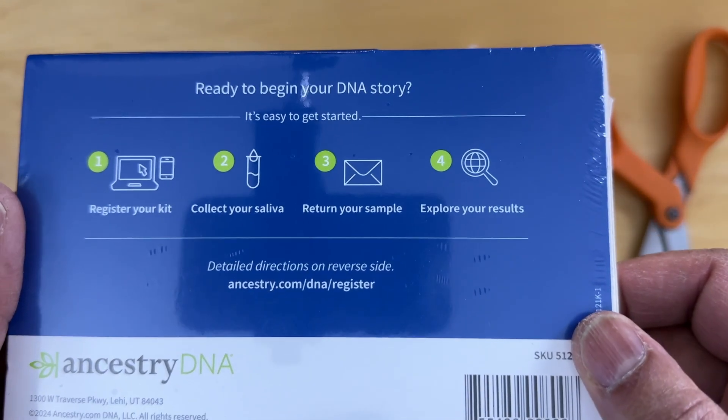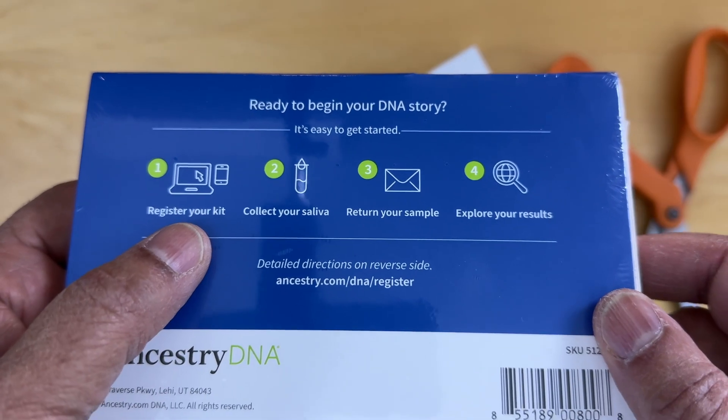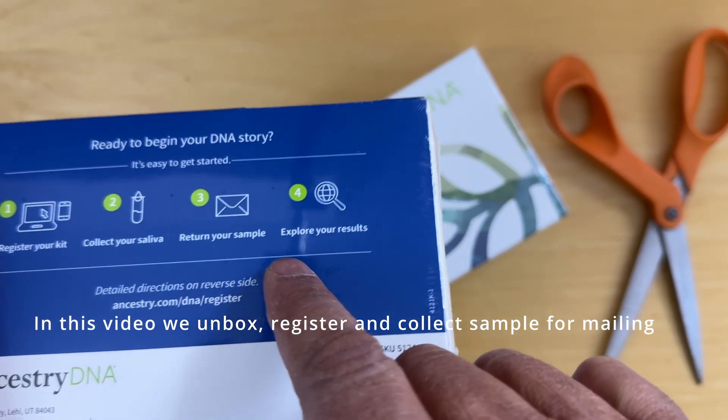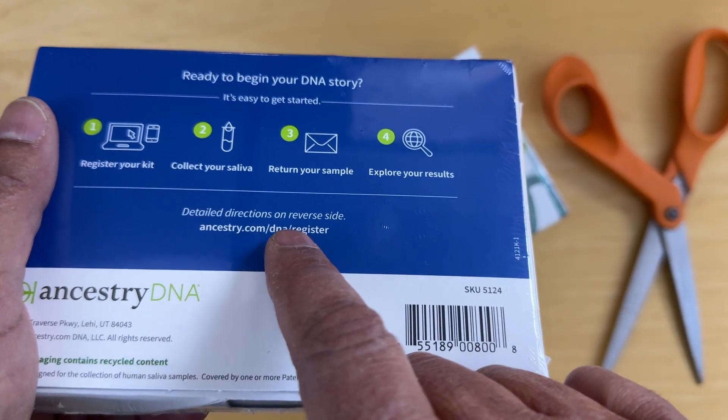It says 'Ready to begin your DNA story.' It's easy to get started — it says register your kit, collect your saliva, return your sample, and explore the results. Detailed instructions are on the reverse side.